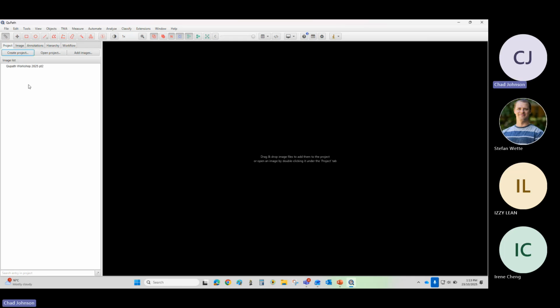And now I have essentially a place to put all of my images, create my objects, create my models, etc., and you can add as many images to it as you want, which are called off specific locations in your computer or on your network.